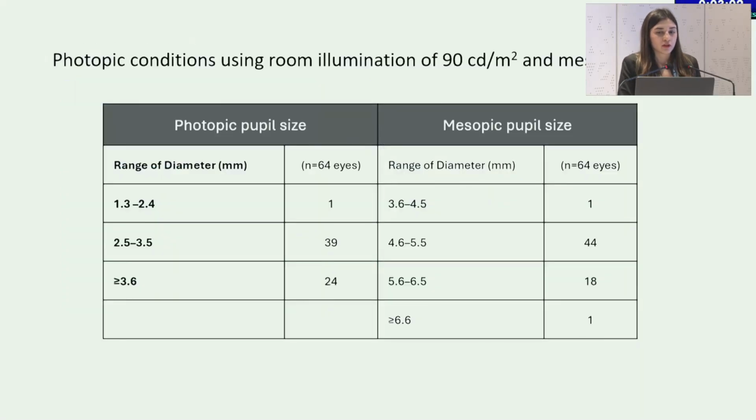When we were matching recipient corneas with donor lenticules, we paid attention to the mesopic pupil size of the recipient patients, and the transplanted lenticules were calibrated to exceed the diameter of the mesopic pupil size by at least 0.5 millimeters to avoid any possible problems at night vision.